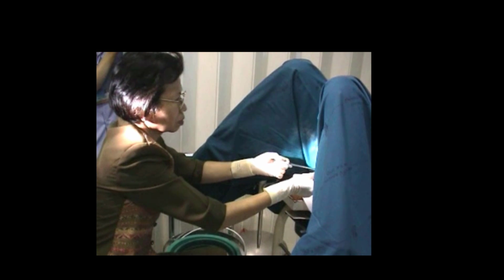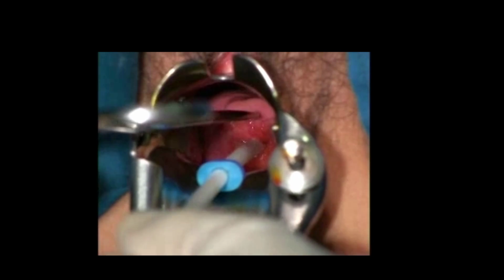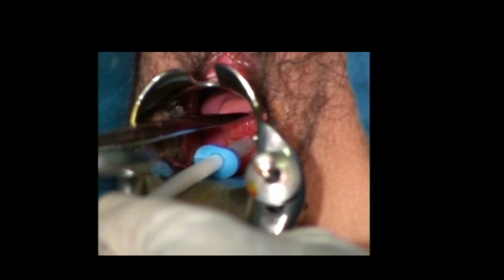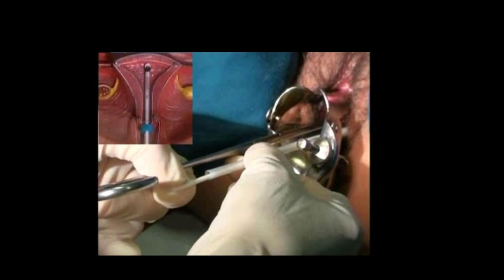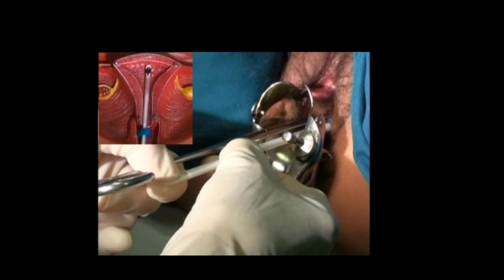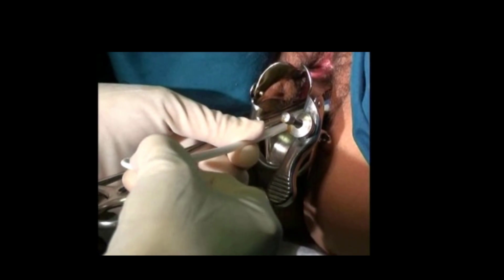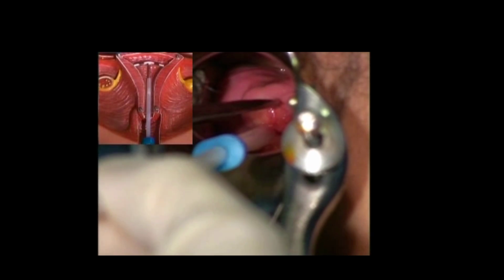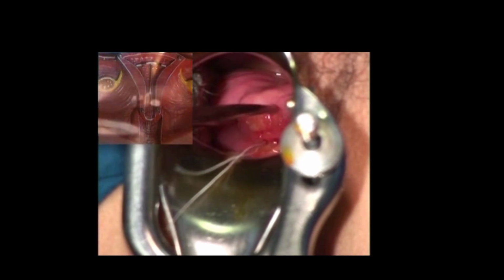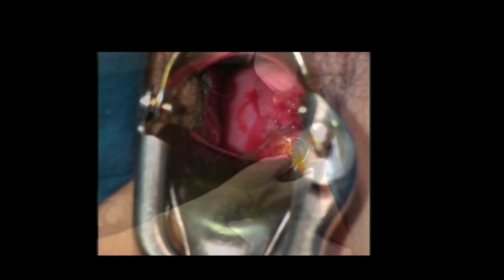Holding the tenaculum forceps with one hand to ease passage for the inserter tube, introduce the loaded inserter tube into the cervical canal until the blue flange reaches the mouth of the cervix. Holding the plunger steady, pull back the inserter tube a couple of centimeters to release the arms of the IUD inside the uterus. Then, first remove the plunger, and then the inserter tube. The final step in this procedure is to cut the synthetic threads to about 2 centimeters from the cervix.